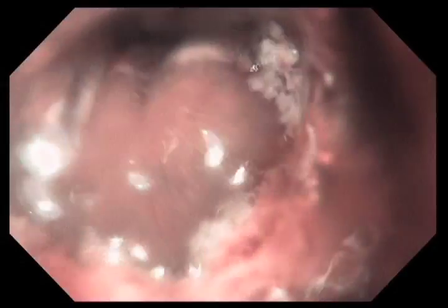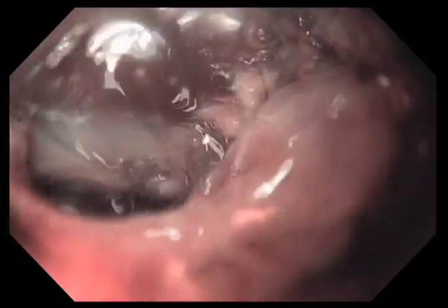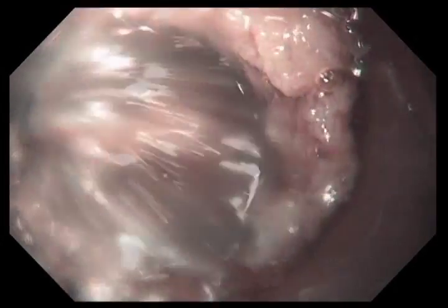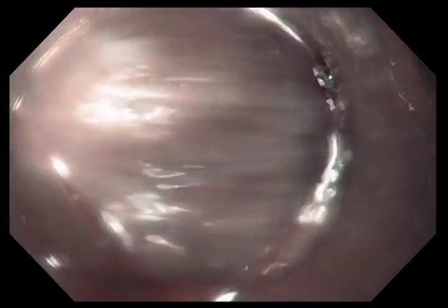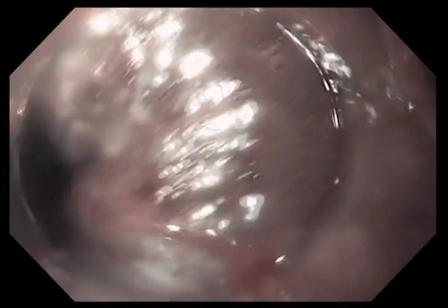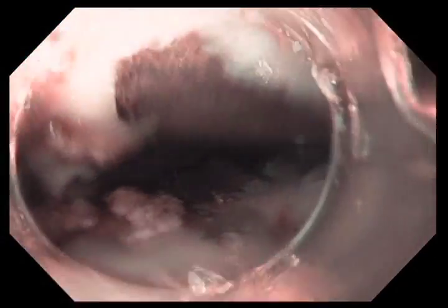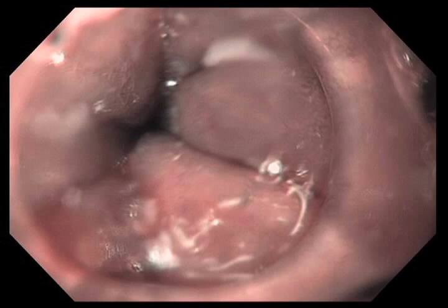We do two treatments — we've just done one, and now we have to remove the coagulum. The key to this technology is to get good contact between the epithelium and the balloon. We've removed the balloon and I'm now using the cap to scrape off the coagulum. Once I get rid of the coagulum and clean the balloon, we'll repass the balloon and retreat this area. The treatment algorithm is to treat the Barrett's area twice: one pulse, then clean and wash, then repass the balloon and treat it again.